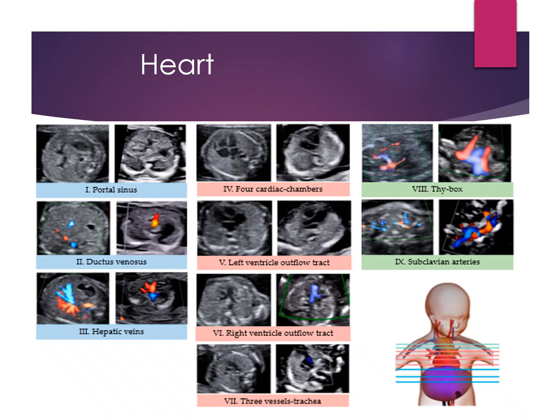Now the heart, it's a beast all of its own, but we're not going to talk about all of these images. If you want to do OB specific, feel free to look at these landmarks, look at a lot of ultrasound, but I want to talk to you about this cutout. Now, just because this baby isn't sitting inside of a mother, at some point it was.